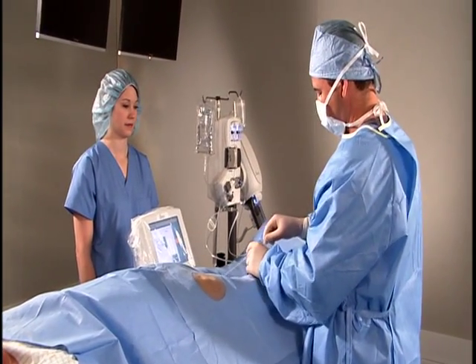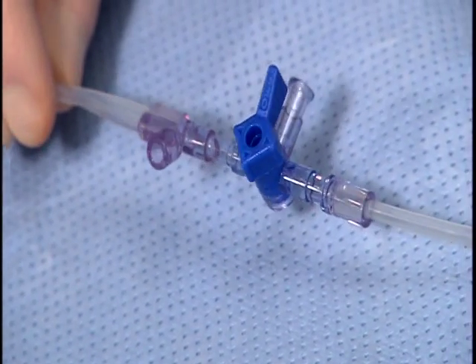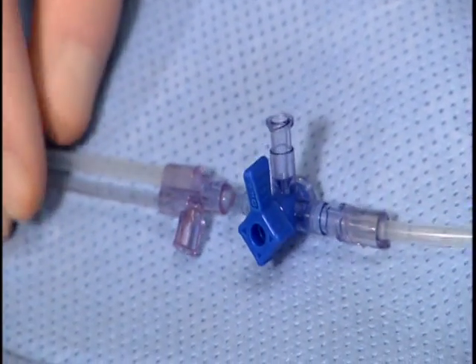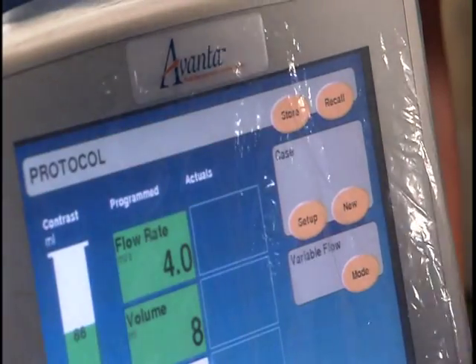The final step of the installation for all SPATs is careful inspection of the entire SPAT to verify that all air has been successfully purged from the fluid path before connecting to the patient. Finally, touch Complete, then touch OK.